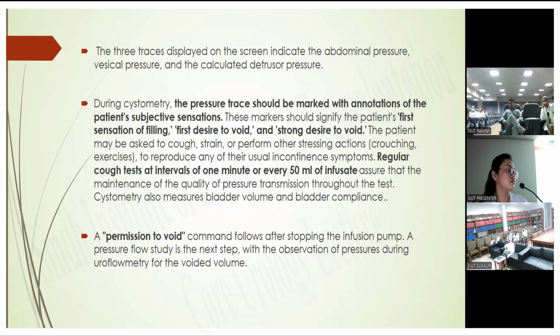Similarly, when you ask the patient to cough, you must put down a marker on the screen, because if you don't, and somebody else is interpreting, they might interpret it wrongly, as there is nothing written there as cough test. So whenever you yourself, as a doctor, are giving a command to the patient to cough, you put a marker there, on the screen as well as on the graph. In that way, the whole process becomes meaningful and the diagnosis is done simultaneously. Nobody would do it afterwards if he or she is doing it himself or herself. So that is one of the advantages of doing it by yourself.